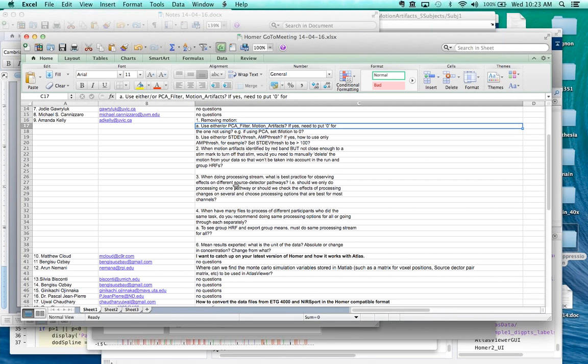So number 3 is, when doing a processing stream, what is the best practice for observing effects on different channels? Excellent question. Okay. So I think Amanda's basically asking, should you optimize the processing parameters channel by channel to get the best results, or use the same processing options on all channels? I've never been asked that question before, but I've been asked the second question, which is, should you use different processing options subject by subject, or use the same processing options for all subjects?